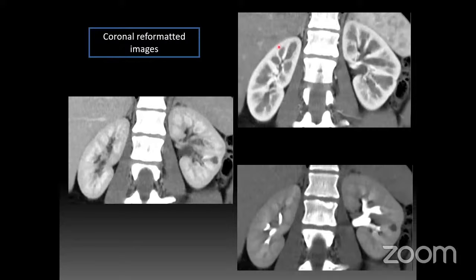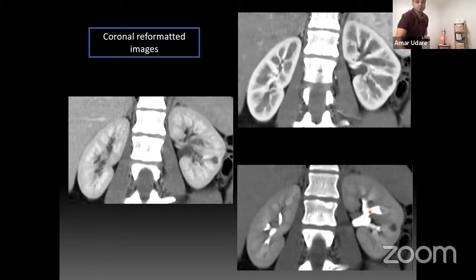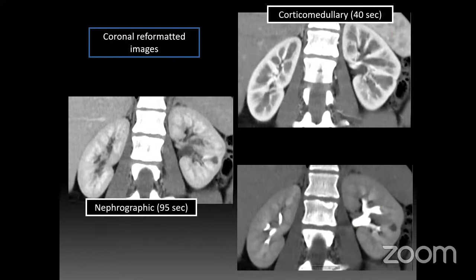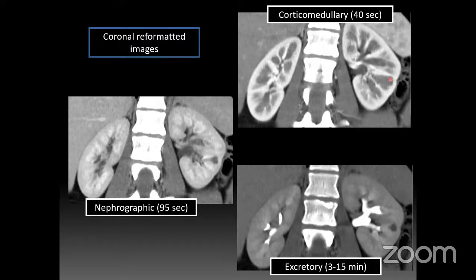On the cortical medullary phase, you can nicely see the cortex and the non-enhancing medullary pyramids, which subsequently enhance on the nephrographic phase. There's a faint papillary blush on the nephrographic phase, which is normal — sometimes more robust in younger patients getting a high volume of contrast. Once nephrographic enhancement proceeds into the calyces, you get the excretory phase. A small hypodensity that can be missed on the cortical medullary phase becomes more apparent on the nephrographic phase — in this case, just a cyst.